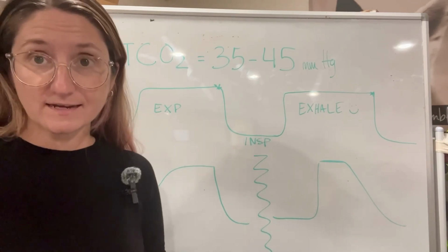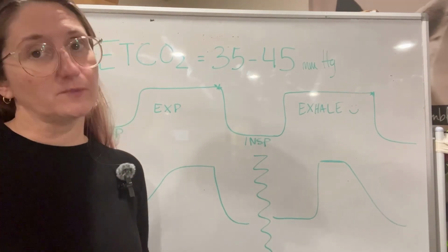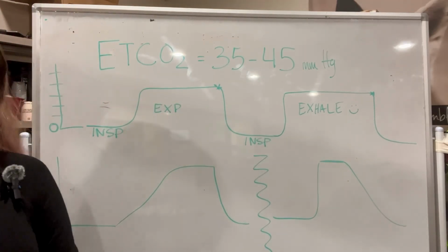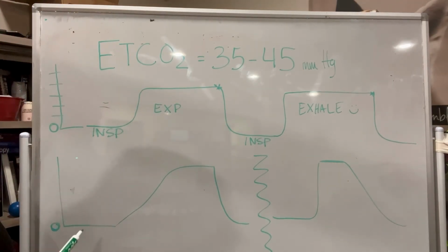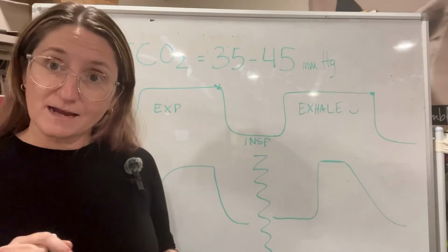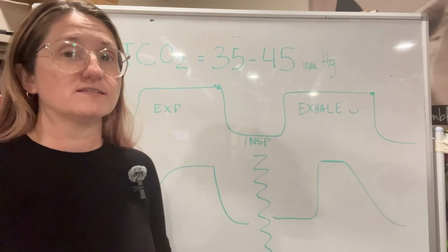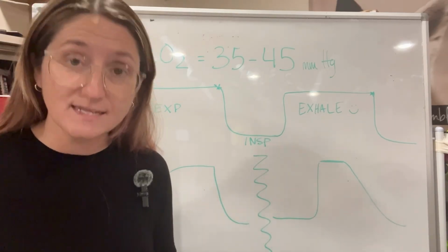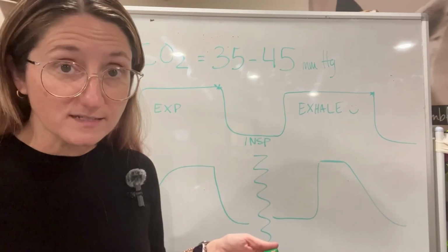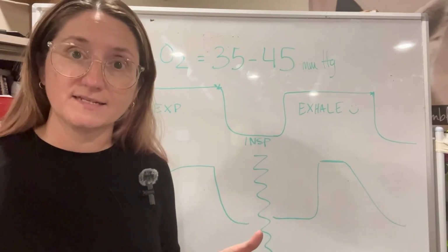We're going to touch on a couple of things that have to do with end-tidal CO2, and specifically reading our capnography waveforms. Now, you'll remember that capnography is the measurement and graphical representation of carbon dioxide concentration in our exhaled gases. The cool thing about capnography is it provides a real-time measurement of what's going on with your patient ventilation-wise. It can also tell you a lot about your equipment if you're having some kind of equipment malfunction in your breathing system. And it can indirectly tell you about cardiac output, and we'll get into it, okay?